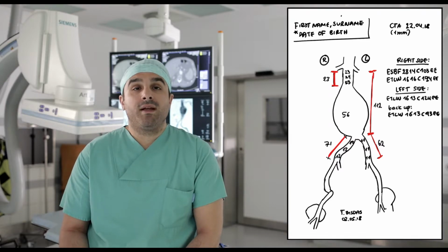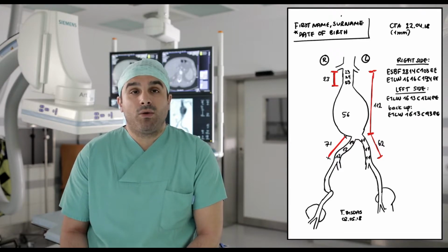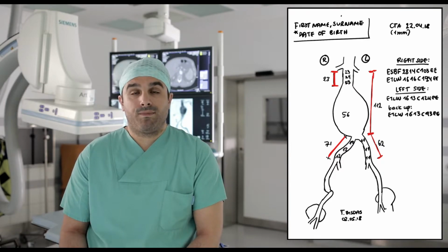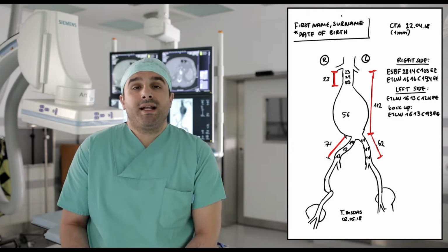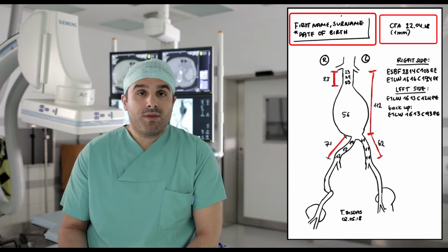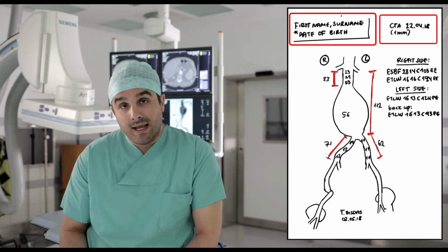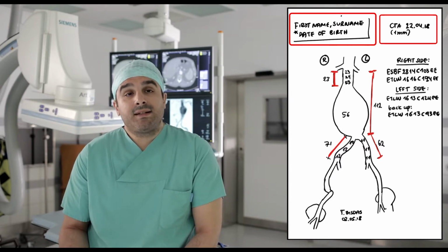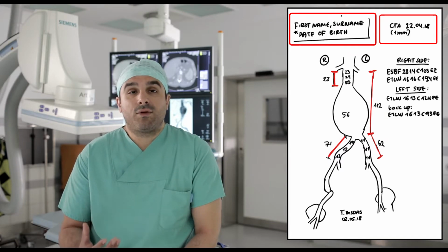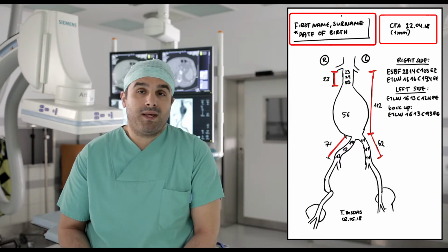The first drawing represents an abdominal aortic aneurysm with a straight neck and a friendly anatomy. First of all, you have to write the data of the patient with name and date of birth, as well as the date of the CT angio. These details are important in order to have a direct access on such information during the admission of the patient.